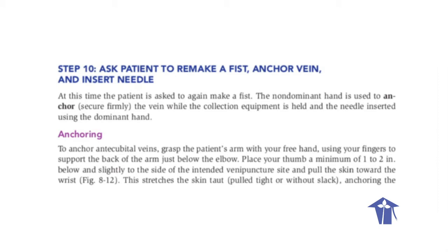Step 10. Ask patient to remake a fist, anchor vein, and insert needle. At this time, the patient is asked to again make a fist. The non-dominant hand is used to anchor, secure firmly the vein while the collection equipment is held and the needle inserted using the dominant hand.